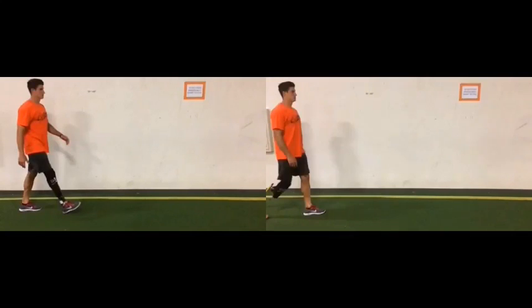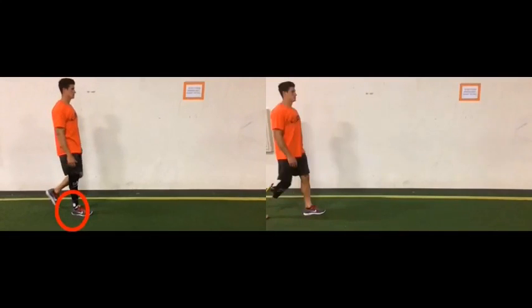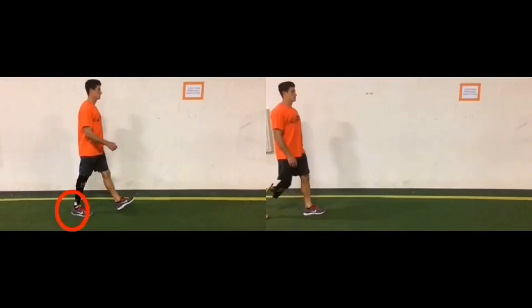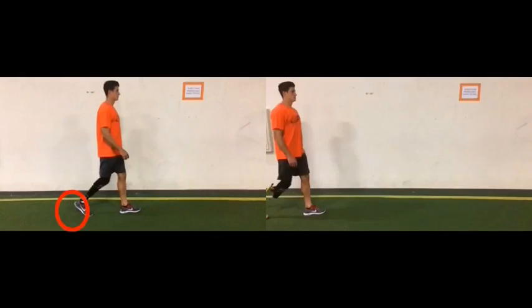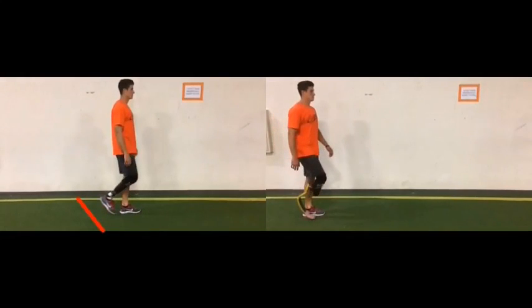We can see that there is a little shock on the heel right here, and that's actually going to help us roll over onto the toe. It's going to give a little spring back as it loads up, and it's going to help propel us forward. There's also carbon fiber on the front of this foot, which helps us roll off the toe. It's going to be loading up as I come off of this toe right here, and it's going to help with the swing through.